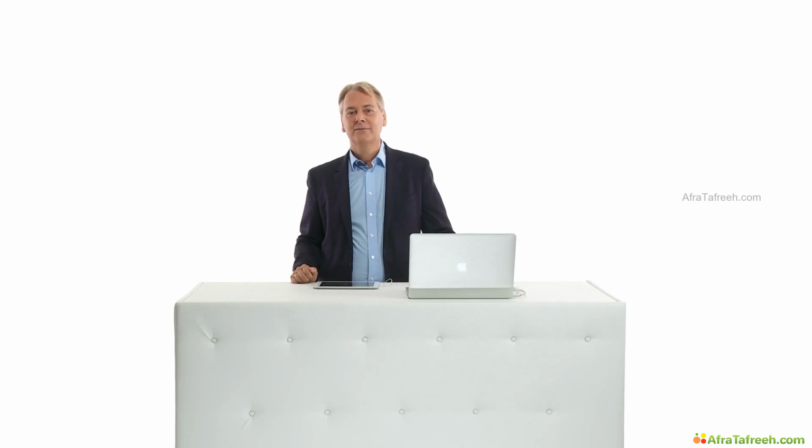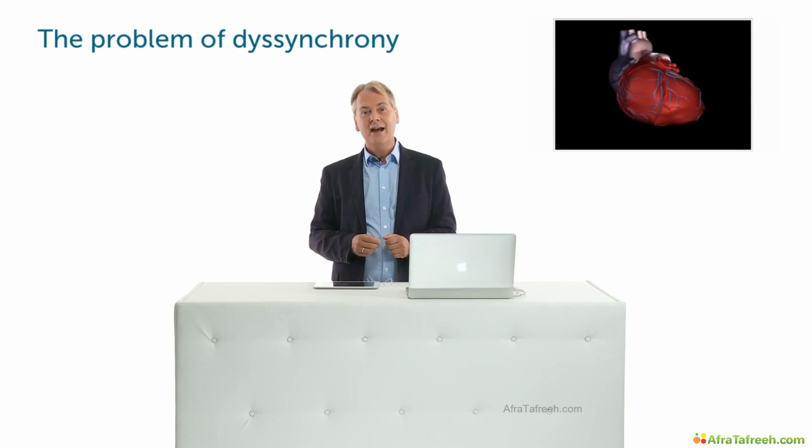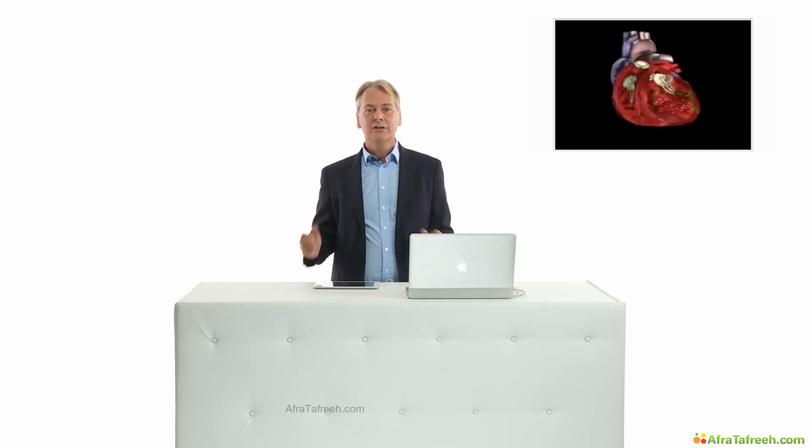Now let's take a look at some diagnostic challenges where the diagnosis is not so easy to be established. One of the most difficult situations, at least in my clinical experience, is to figure out if a patient really has a reduction in left ventricular function if there is dysynchrony, a left bundle branch block. Here's such an example. Now, the problem here is that it's very difficult to define when we actually have systole and diastole because different portions of the myocardium contract at different time points.